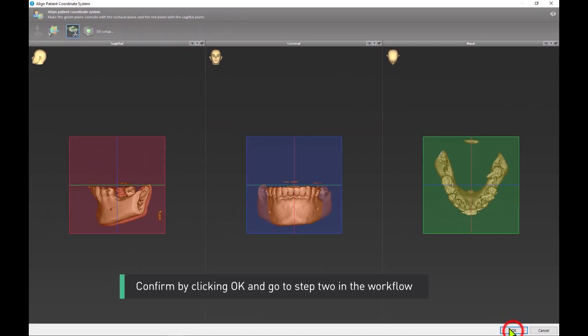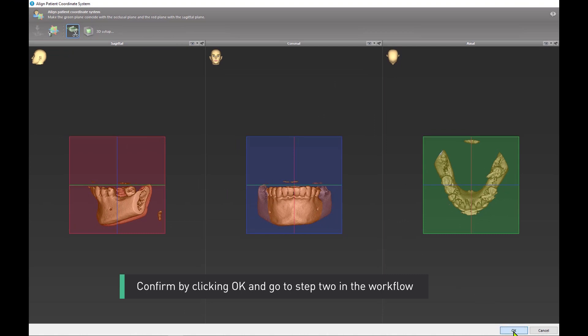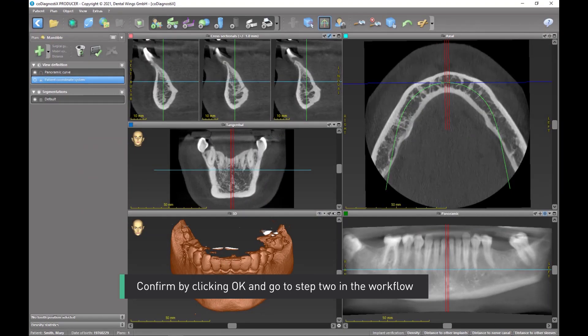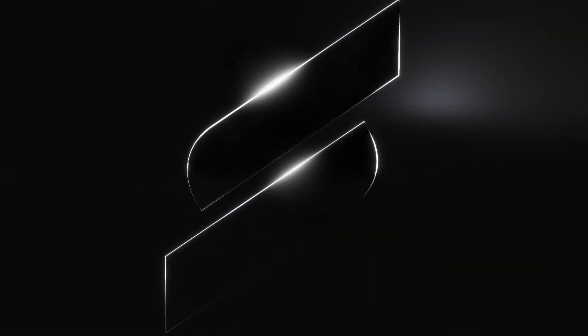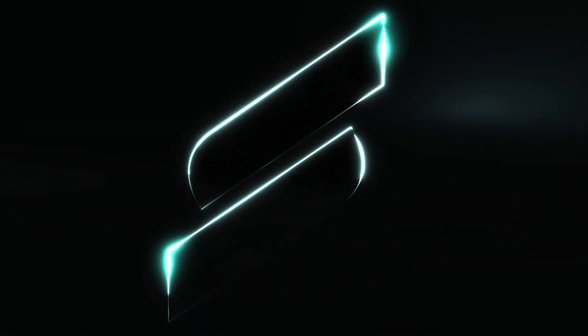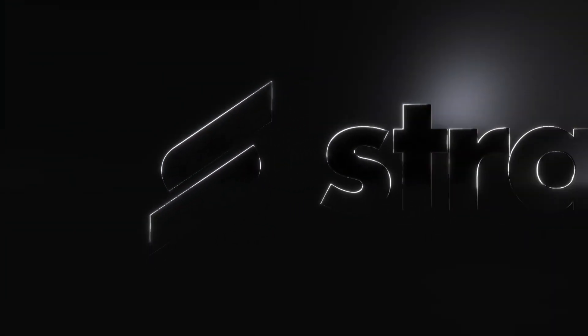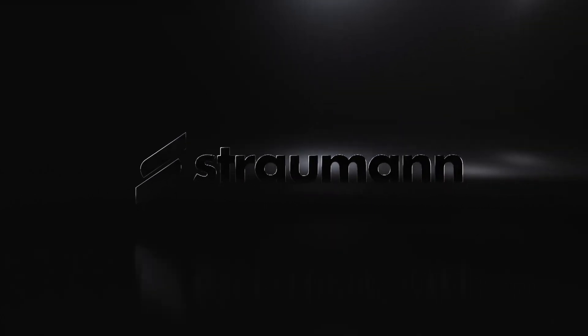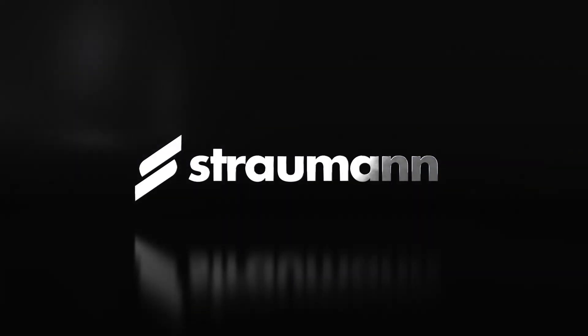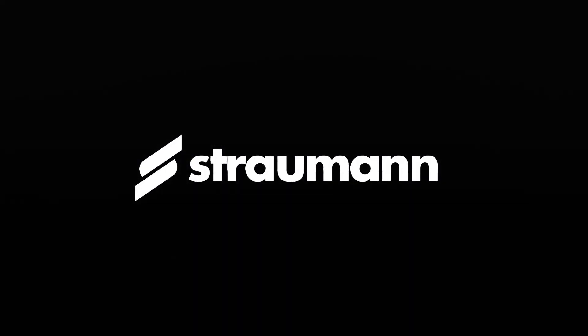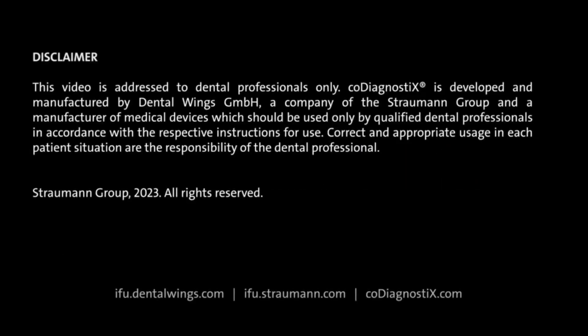Confirm by clicking OK and go to step two in the workflow.